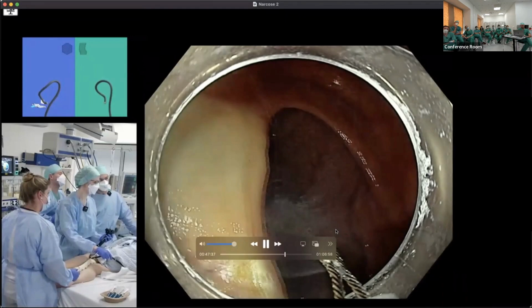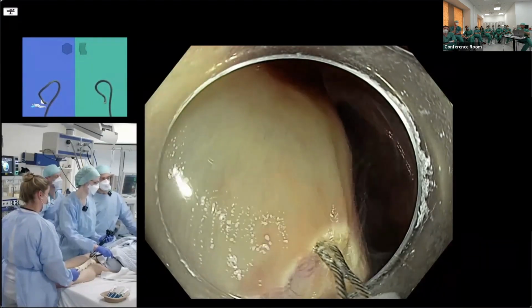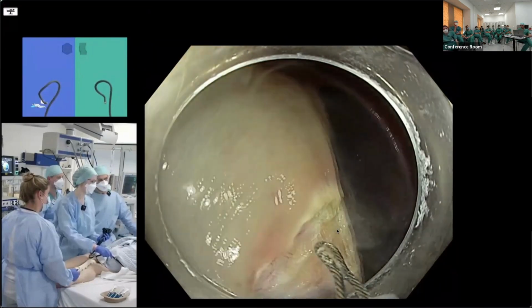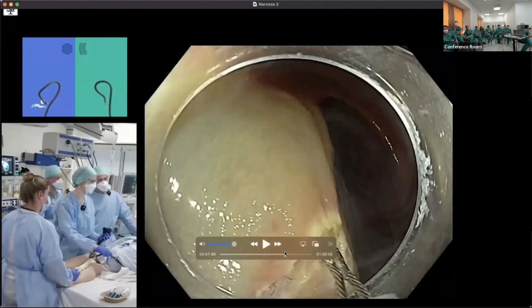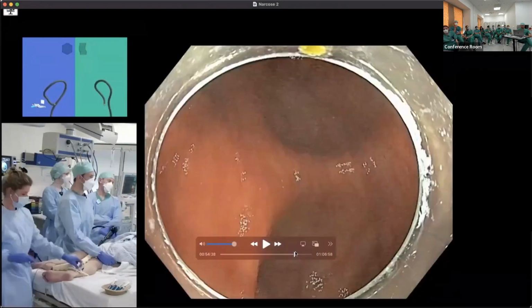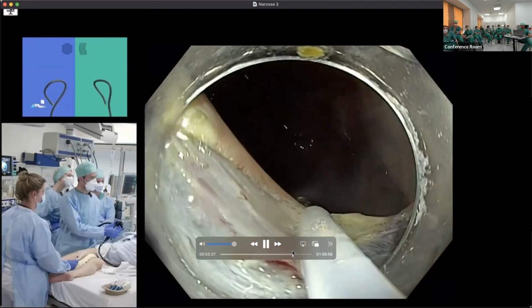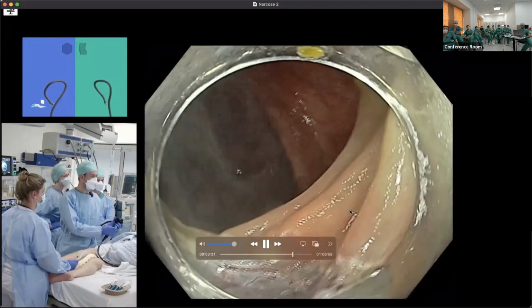So here, what you're doing is too en face. Like you have the tip like this and the mucosa like this, and you don't really get a good burn. You have to sit it down on it. And you see the difference between that, and you're getting not enough rim there. And then the difference between that and, I guess this sort of thing where I'm actually too far from the scope. I don't like it like that, but I see it's going to be difficult. And you see the plastic is just coming in on the edge. So that's one thing to do.